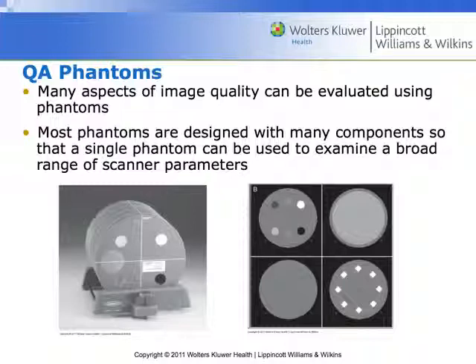So this phantom here, we can see it has a spot test, it has a water test, it has another water test, and then it has some kind of spatial resolution test. All of those are stair-stepped into that phantom. So if we look right here, we see different lines, and each one of those is going to be different tests that the phantom can do.